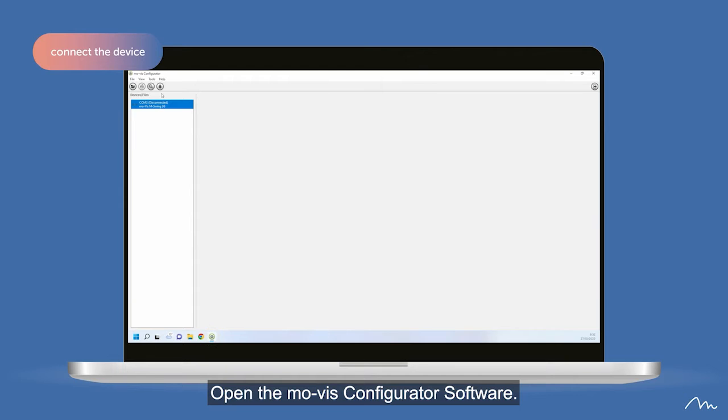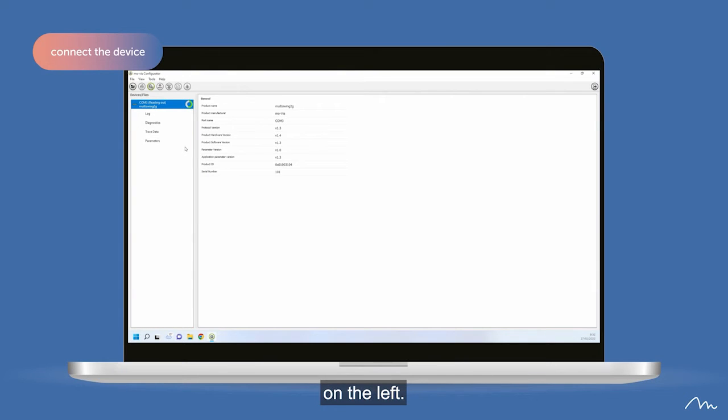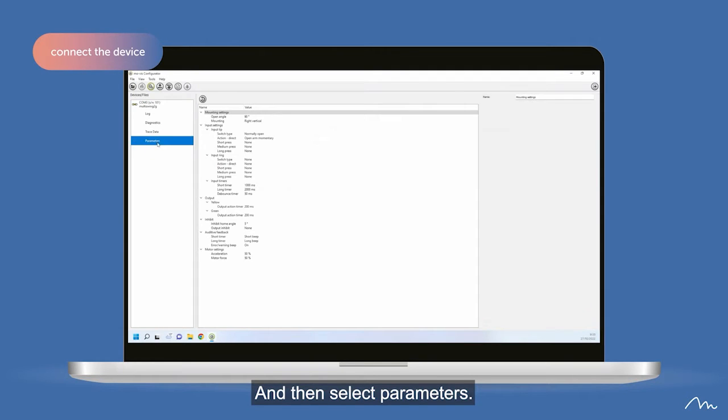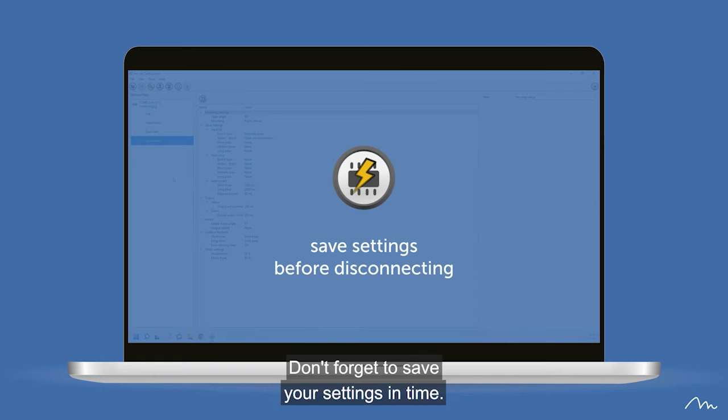Open the mo-vis configurator software. Click on the Connect icon and your device will pop up in the toolbar on the left. And then select Parameters. Via the panel in the middle of your screen, you can configure several parameter settings. Don't forget to save your settings in time.